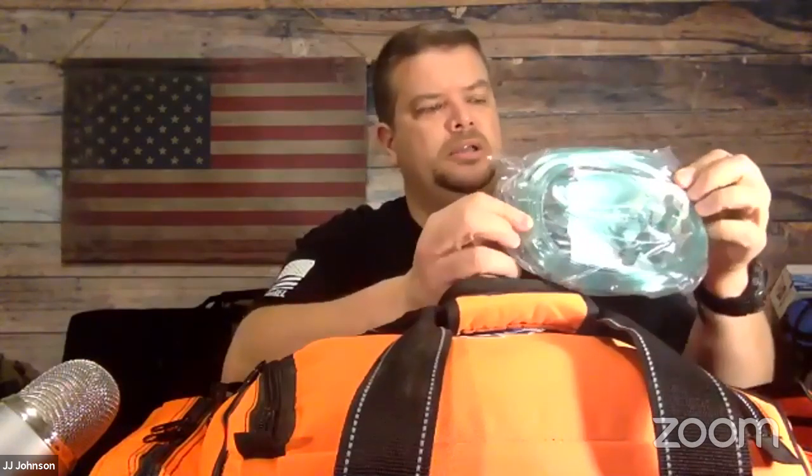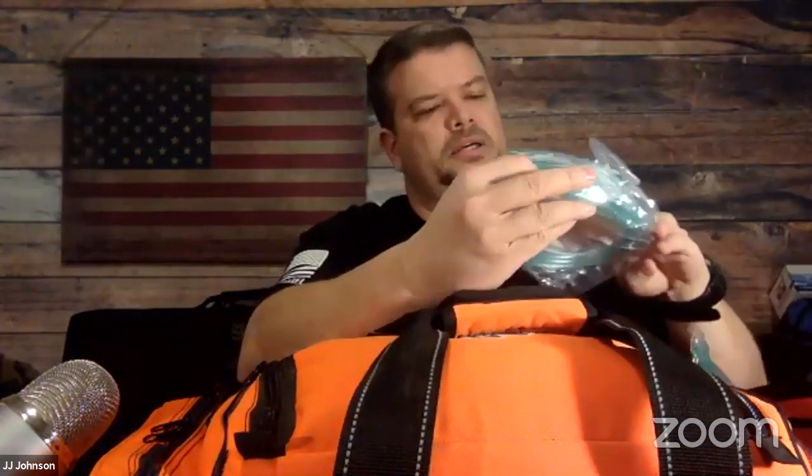Okay, so we're going to go on the end pocket over here. And so here we've got an oxygen mask and oxygen tubes. This is kind of one of those things that I'm probably not going to have any oxygen with me, but I thought perhaps these tubes and all that kind of stuff could potentially be useful for something. Same thing with these. It's a couple of nasal cannula, two packages of those. These came with the kit, and another oxygen mask.